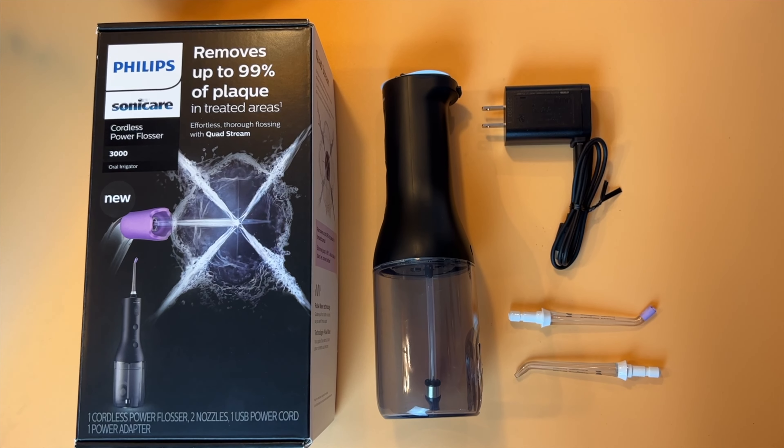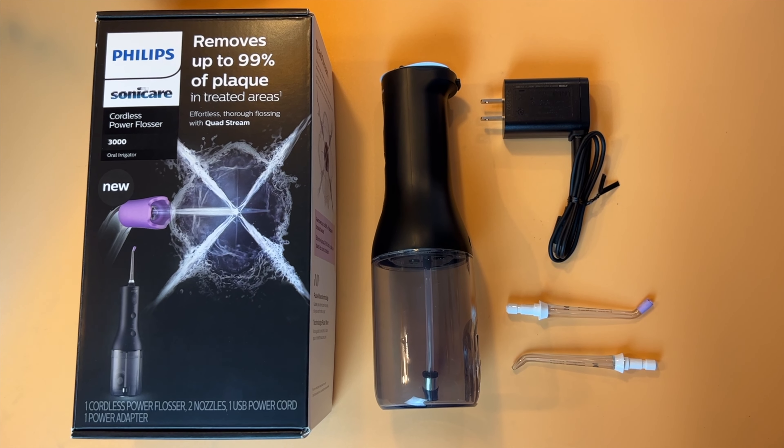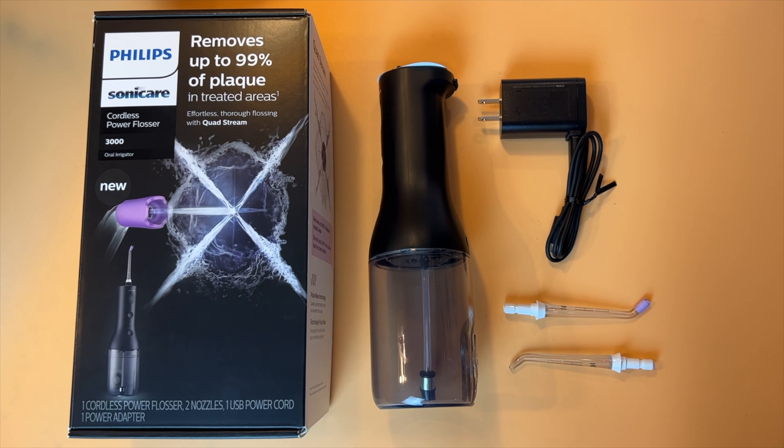The biggest downside of this device for me is the extremely pricey replacement nozzles. At about $25 a pop or $50 for a two-pack, the cost will quickly outstrip the original price you pay for the water flosser. Even so, this device delivers on its promises and it has made me a new fan of the Philips Sonicare Cordless Power Flosser — and I think you will be too. It sells for about $79 both in the US and Canada and you can get it from places like Amazon.